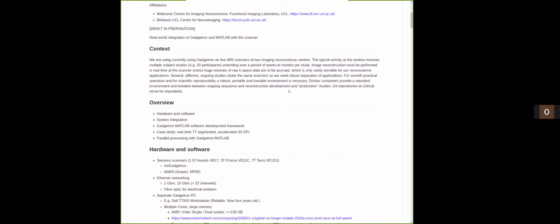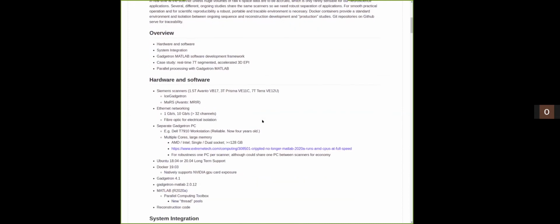And one technology which is really handy for this is Docker. And that allows both for an orderly operation of different studies, which can be based in different containers. And also the containers provide a reproducible and traceable environment for being able to perform the same investigation repeatedly. And another technology is obviously Git and GitHub server, to allow us to have traceability of different versions of systems.